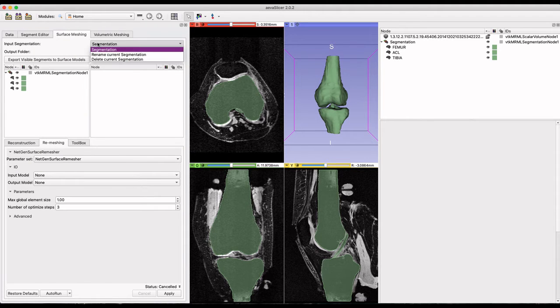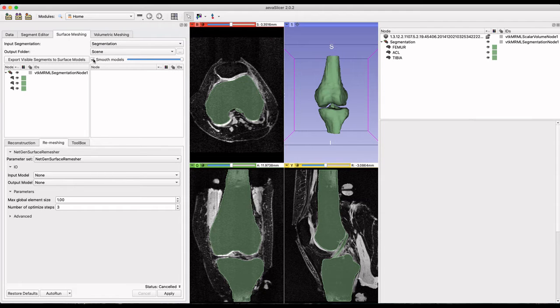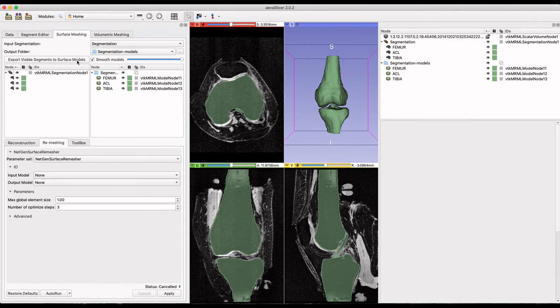From the home module, we have the surface meshing tool. To create the surface meshes, select the input segmentation to bring up the three label maps to be meshed. Then select export visible segments to surface models.